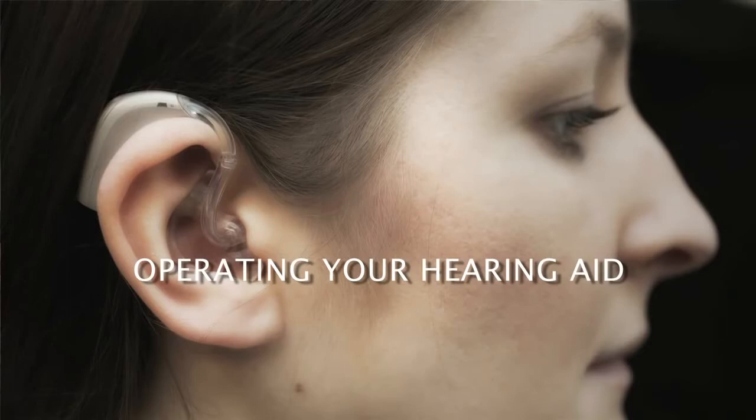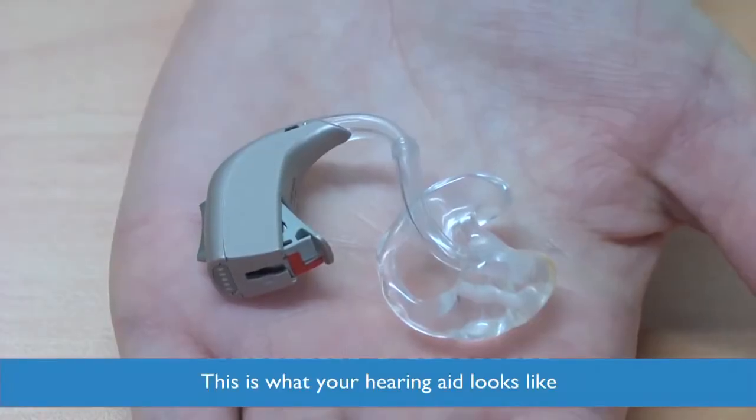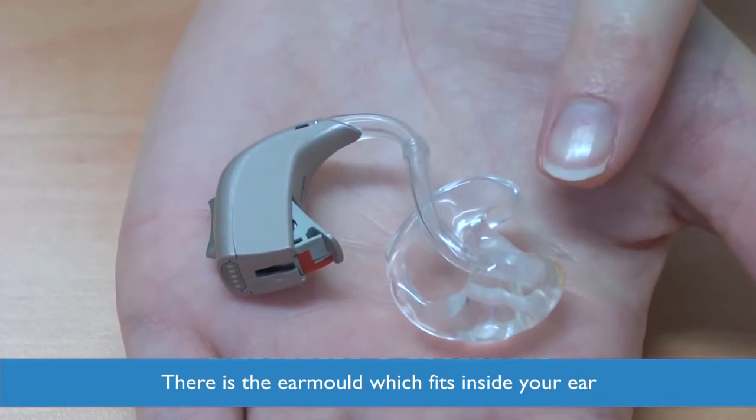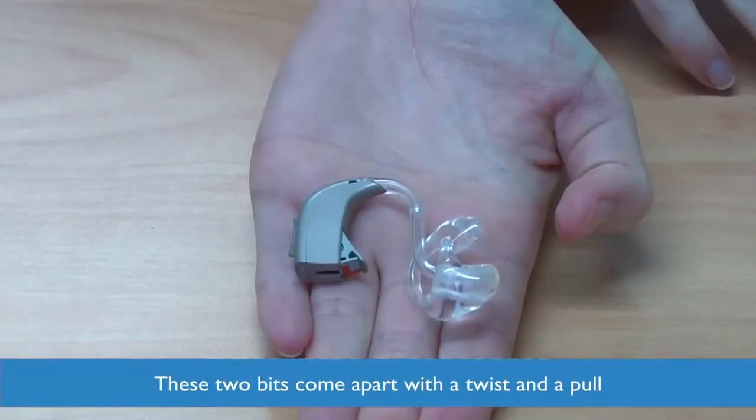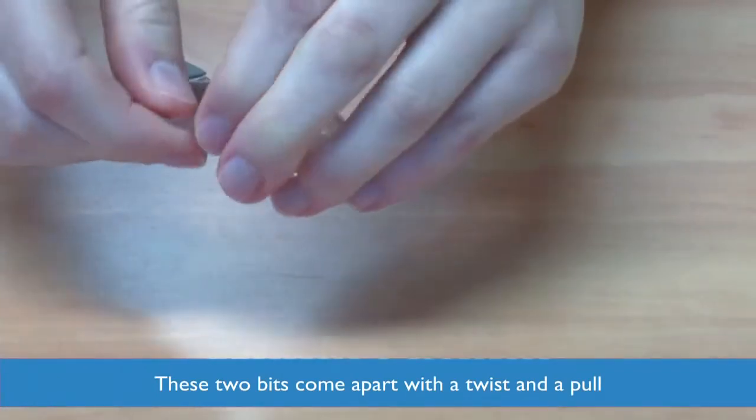Operating your hearing aid. This is what your hearing aid looks like. There is the ear mold which fits inside your ear and the hearing aid which goes behind. These two bits do come apart with just a twist and a pull.